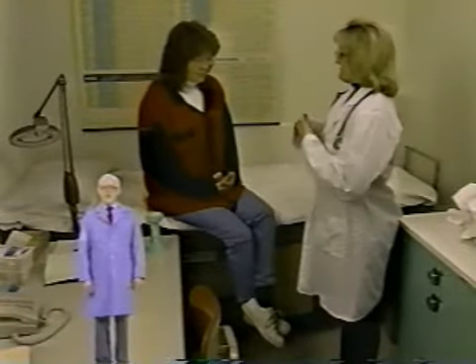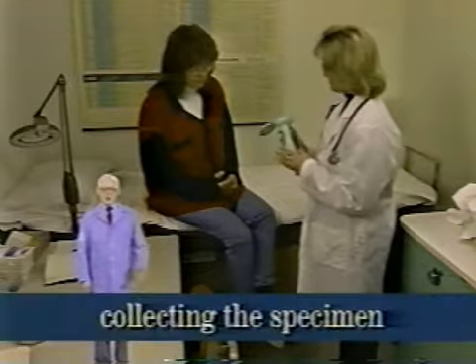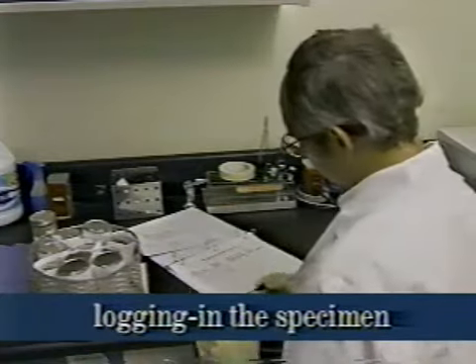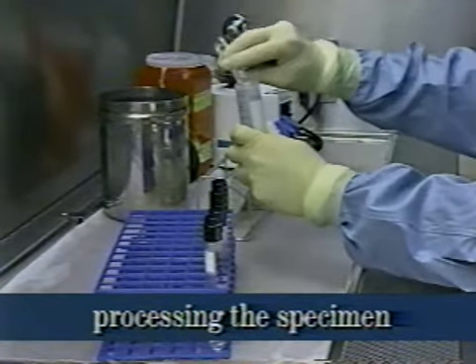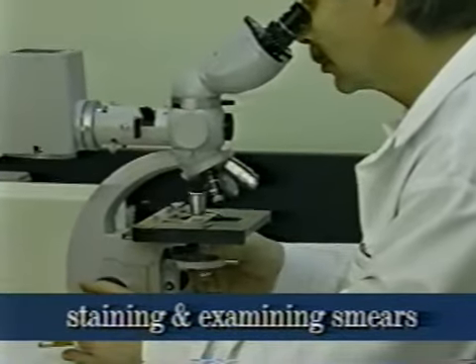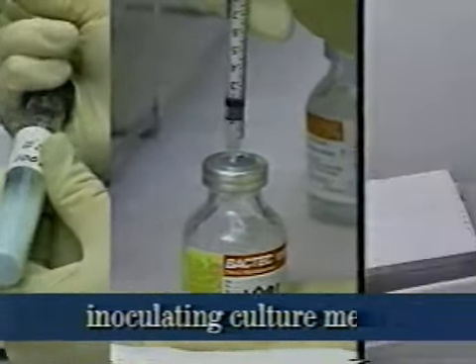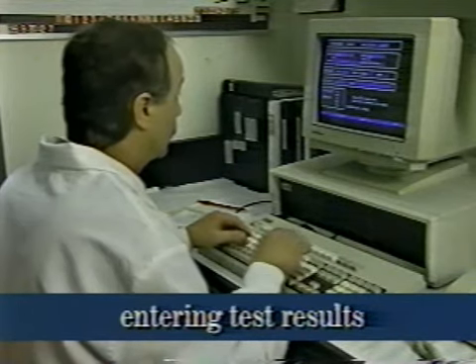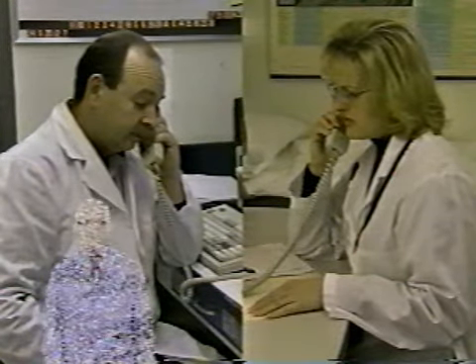Let's take a quick review of the laboratory testing process and the events that might cause a false positive result to be reported. Collecting the specimen, receiving the specimen in the testing laboratory, logging it into the record system and assigning a number, processing the specimen, adding reagents, centrifuging, staining and examining smears using acid-fast microscopy, inoculating culture media for isolation, identification of the isolate, entering test results into the patient's records, and reporting results to the attending physician. The testing process certainly has a lot of parts, doesn't it?